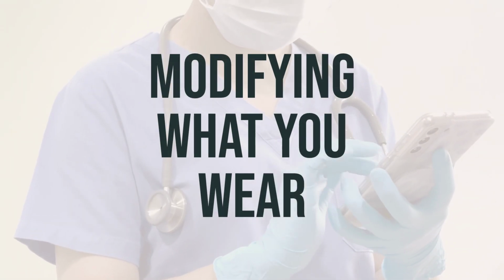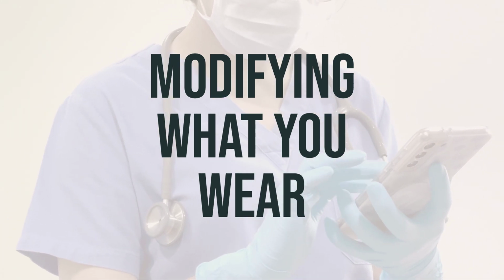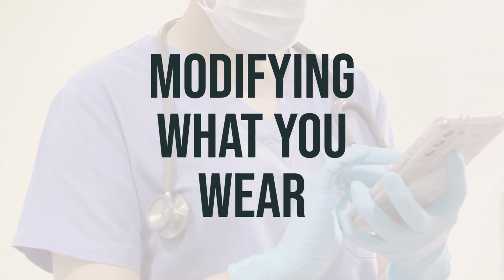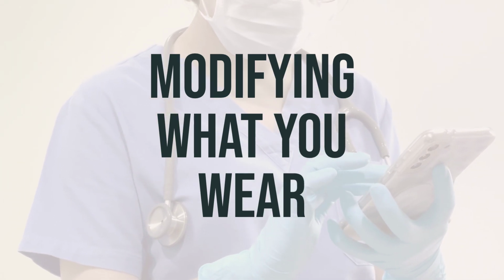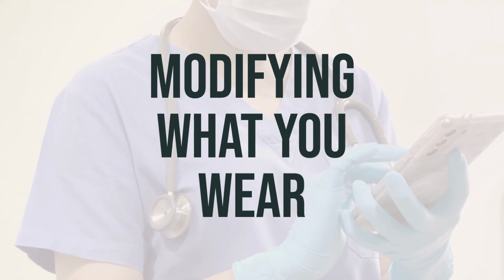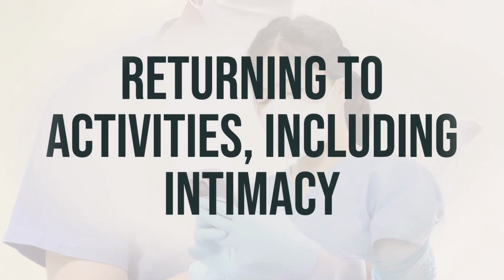You might be worried that wearing tight clothes will make your pouch visible to others. However, there are ways to hide your pouch if needed. You can use special wraps and underwear to keep it out of sight. Some people also find that using colors and patterns can help disguise their stoma. For example, if your stoma is above your belt line, wearing a patterned shirt can help, and if it's below, wearing patterned or dark pants can do the trick. Men can also switch from tight belts to suspenders, which can help hide their pouches.